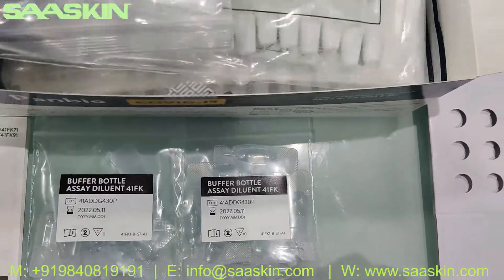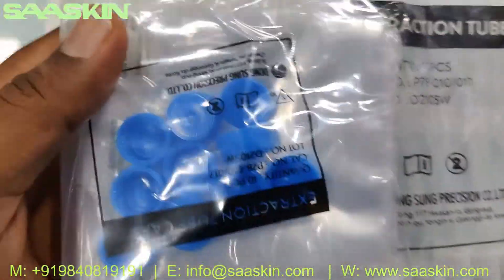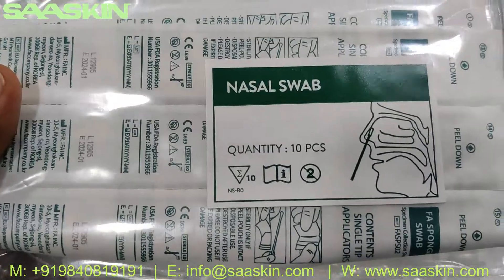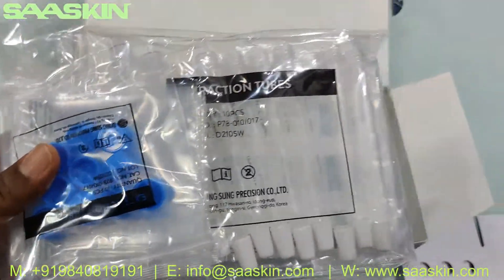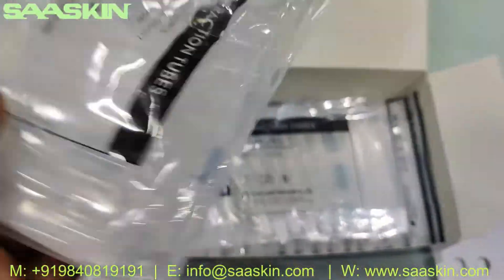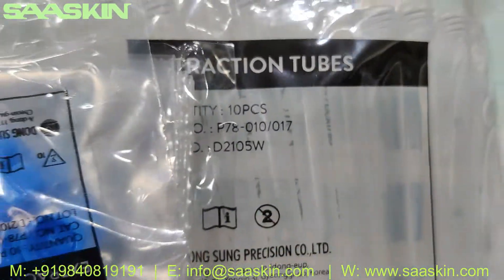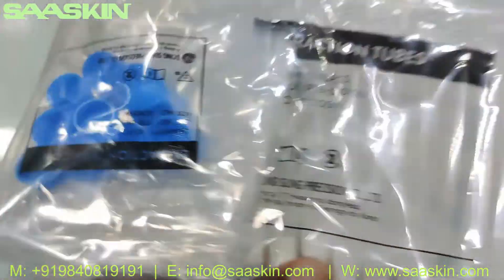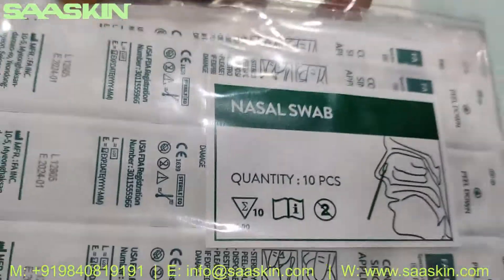You also get two packs of 10 extraction tubes along with the caps. And there is also a nasal swab stick inside — a separate 10-set pack. So you have the extraction tubes, 10 pieces per pack, with the tube caps and the nasal swab stick.